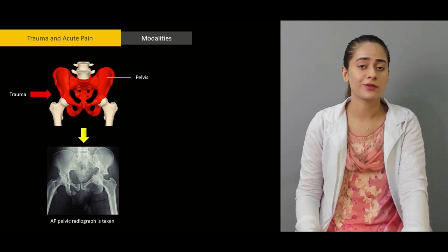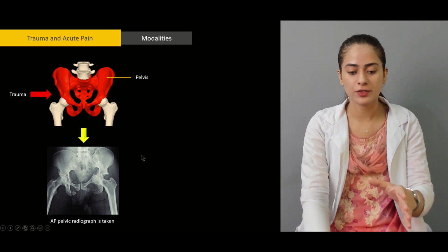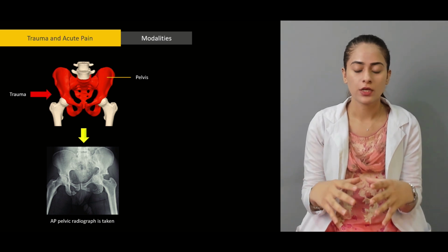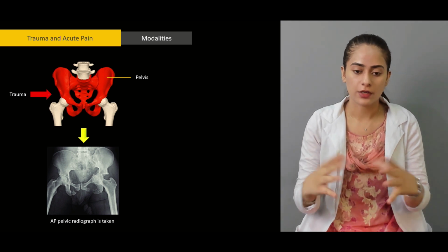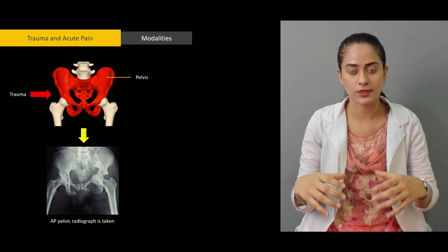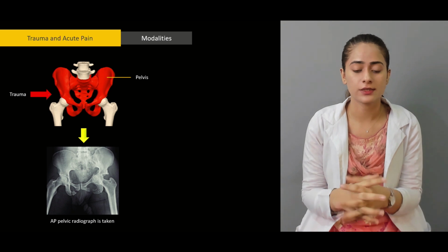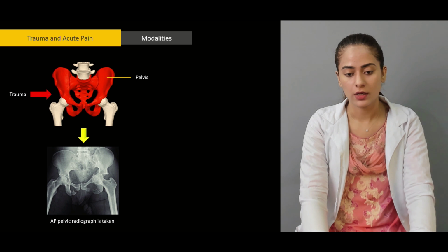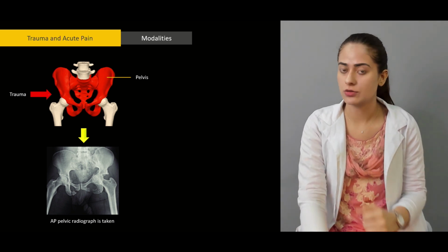It's accompanied by a lot of blood loss as well. Pelvis fracture is one of those fractures you suspect whenever somebody comes into a trauma center. The first thing that anybody suspects is a pelvis fracture if there are signs of intense blood loss somewhere in the body. So this X-ray is among the first things asked for whenever somebody comes into a trauma center.